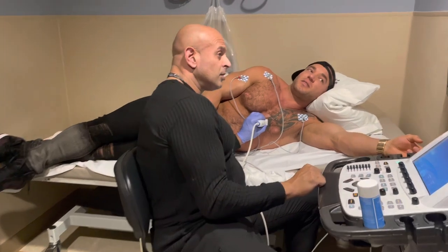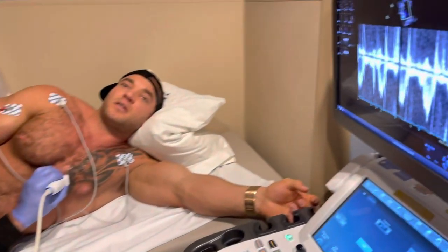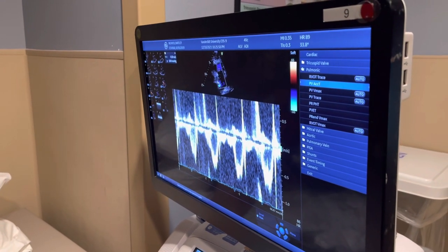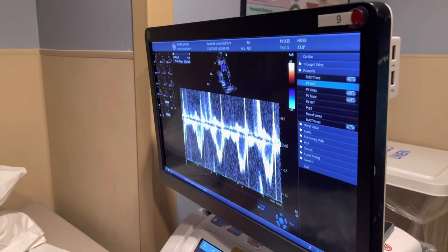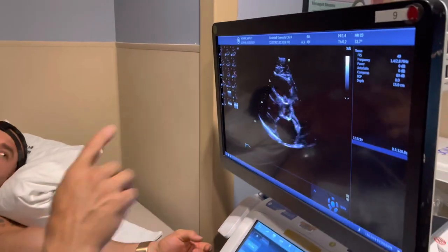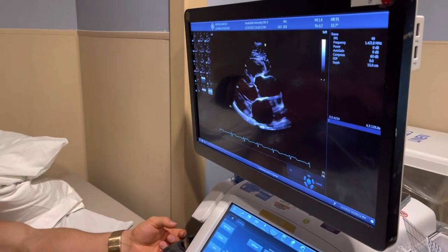So you can listen to different valves? Yeah, we Doppler them and we see the flow through each valve. But the sound of them — that's not what matters. What matters is we look at the flow, the color flow, the direction, all of that.